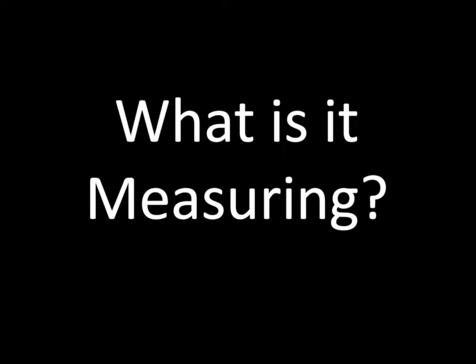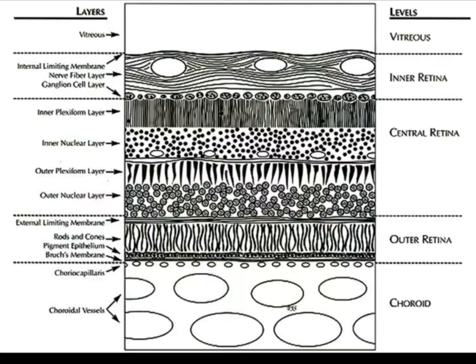So the first thing, and the most important thing, is what it's measuring. Now, we've all been to OCT courses, and we jump right into the meat of the discussion when we're talking about OCT and how it's utilized in the practice. But I think it's important to take a step back and really understand what we're looking at here, because it is such complicated information, yet it's presented so simply when we're looking at the scans.